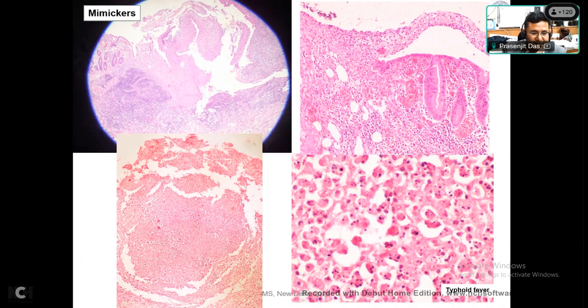This is the exudate, and this is the deeper part of the ulcerated area where we could identify numerous hemophagocytosis. You can see all these are histiocytes, so hemophagocytosis is very prominent. So if you see an ulcerated ileal disease like this, no granuloma with very prominent hemophagocytosis, this is a complication of which disease? Any students can tell that? Where do we see this? This is an example of immune dysregulation, or what you see in systemic inflammatory syndrome. So this is an example of typhoid.